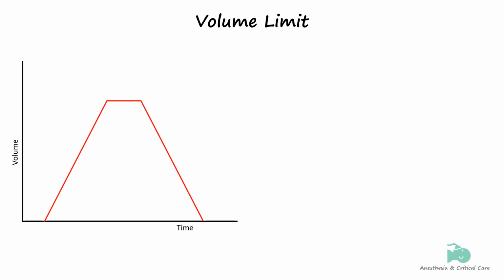A volume-limited breath is delivered by the ventilator by measuring the flow of air delivered during a specific time period. This volume will be the maximum amount of gas that will be delivered to the patient during an inspiration.